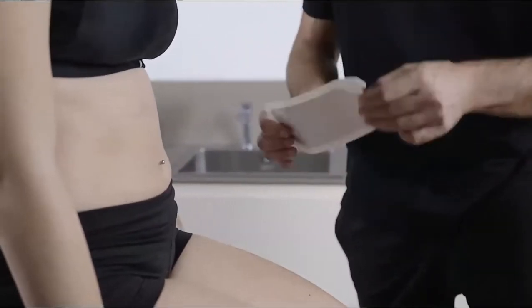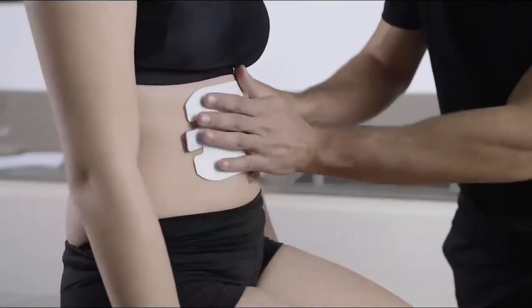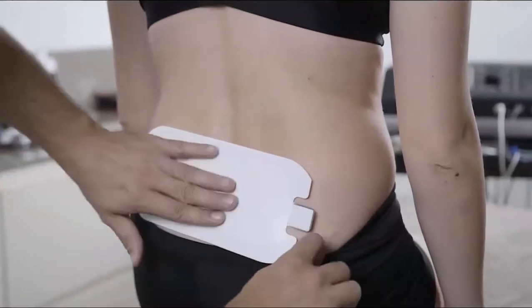During TEKA treatments, has it ever happened to you to treat a patient who needed a specific mobilization but you felt limited by having an electrode or handpiece keeping your hands busy?